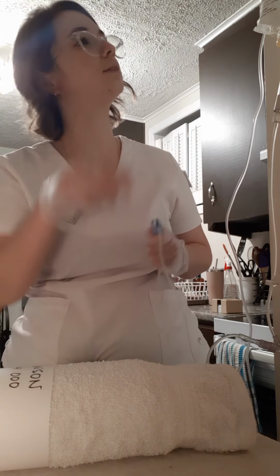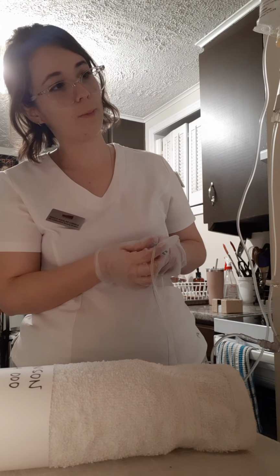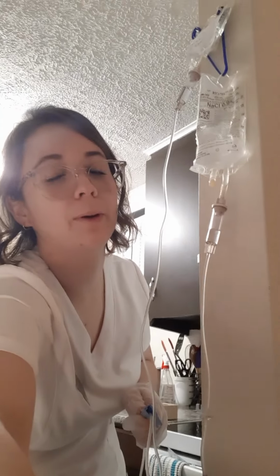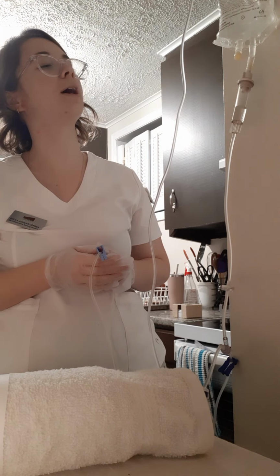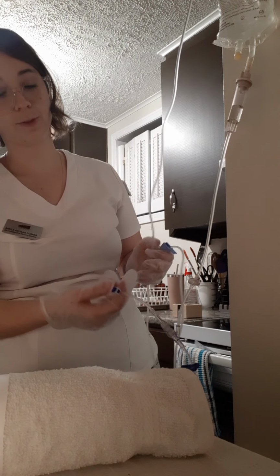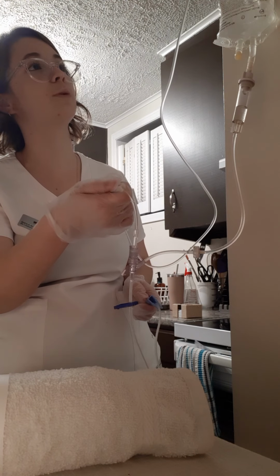Okay, so I'm looking at this one here. Sorry, I'm looking at the secondary line, so this one here. So I'm going to open it a little bit. So I got my medication up and my primary line down. Okay, I'm going to open it, and I'm going to count the drops that fall. Oh, sorry. I'm supposed to open this one, the secondary line, the clasp of it. I'm supposed to open it.